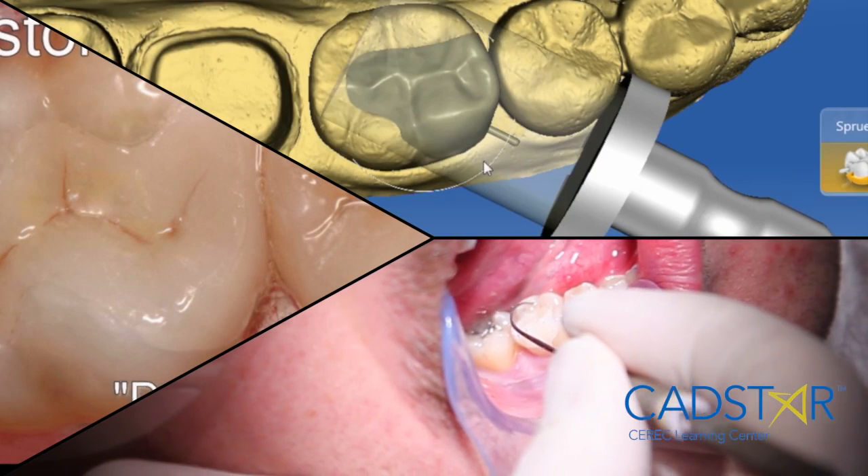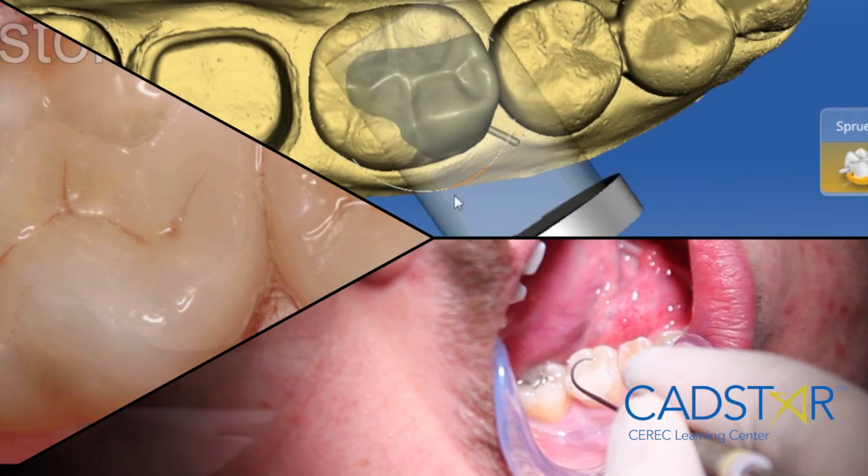I think that will clarify the metric system to use for your parameters to get a Lava Ultimate result as you would expect — gold. I learned with gold, and those are my expectations for my seams. I don't want a significant cement seam; that's where I see premature aging on these types of restorations. It's never been better with 4.0, and now for inlays on those cable surface margins, the Lava is knocking it out of the park.